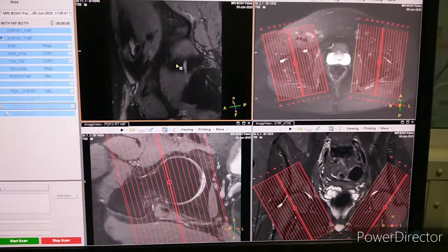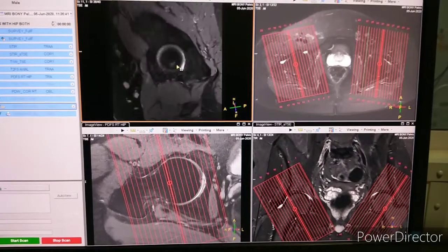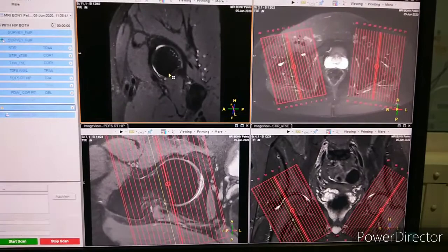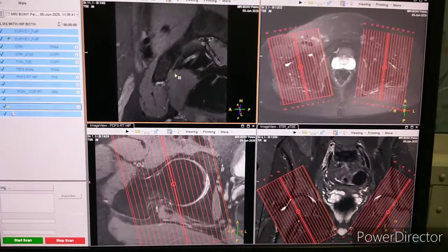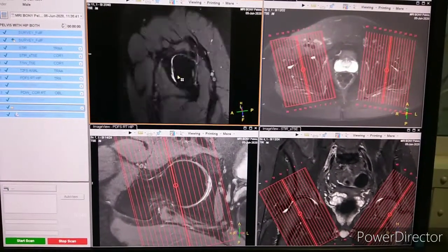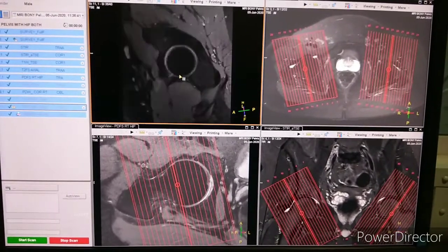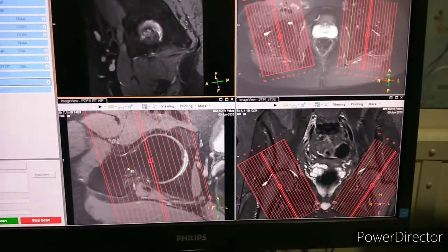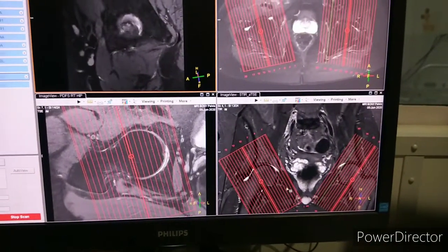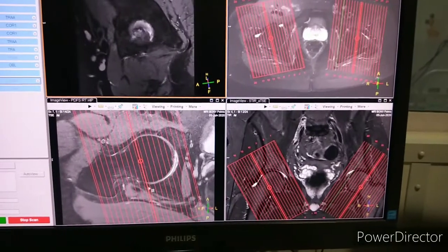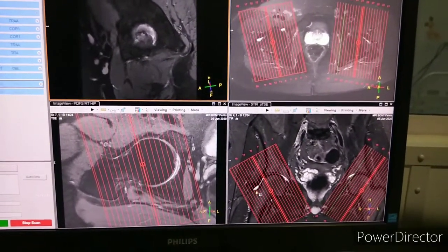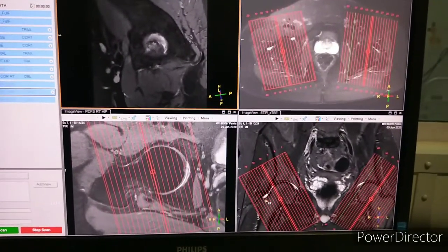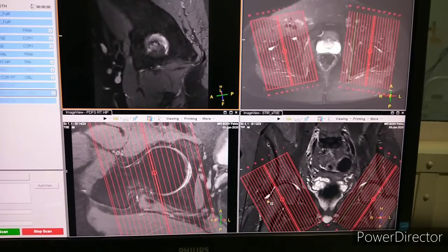The last sequence is PDFS oblique sagittal for bilateral hips. You can see — scrolling down — this is the right hip oblique sagittal, and we are coming down to the left hip oblique sagittal. You can see planning on axial and planning on coronal. You have to take it according to the neck of femur. Thank you guys — if you have any doubt, please comment.